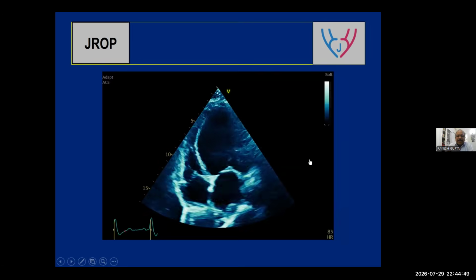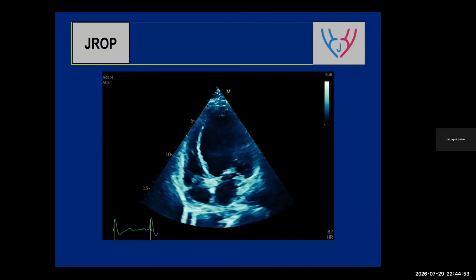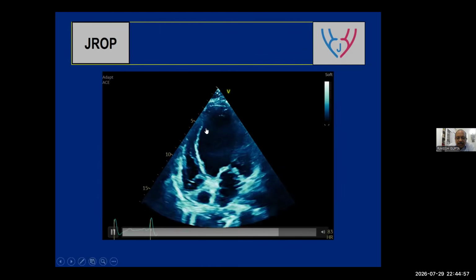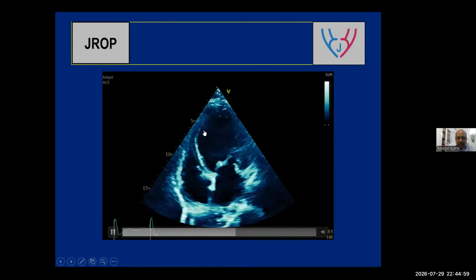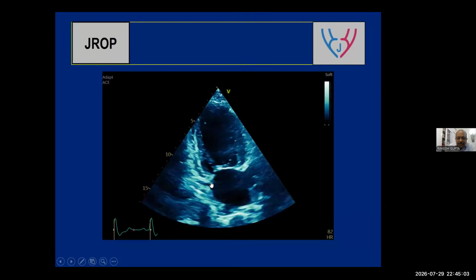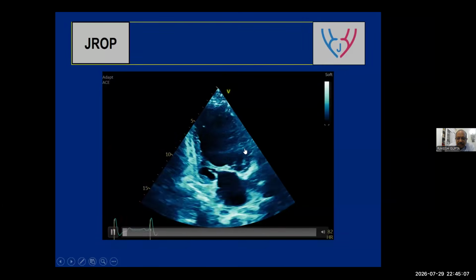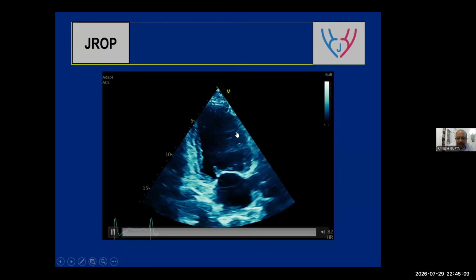Septum also. Now look at the septum finding. Septum is good, sir. Akinetic septum. Whole of the septum is akinetic. Yes. Mid and basal septum is akinetic and hyperechoic. Inferior wall is fine. Basal anterior wall is fine. This is almost akinetic.